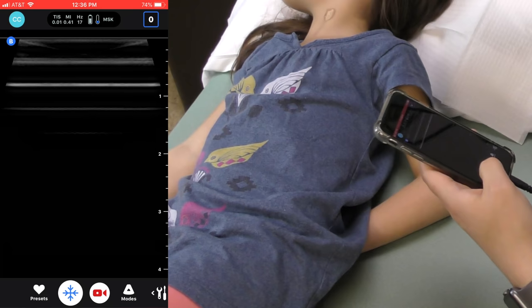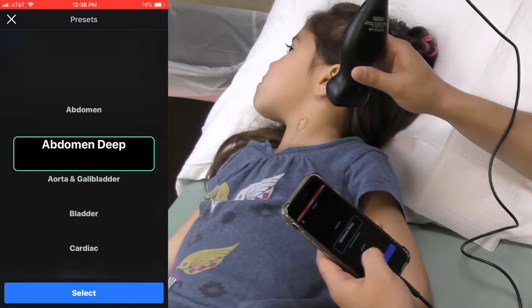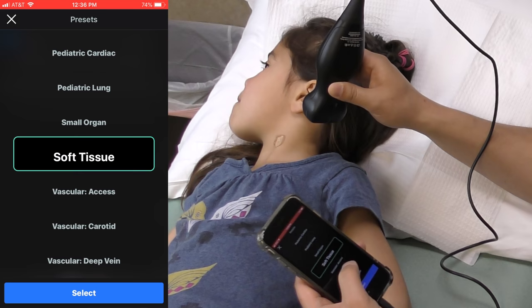There are a variety of presets to automatically adjust settings for optimal images based on the body part being examined. In this case, as an ENT clinician, I have selected the Soft Tissue preset.